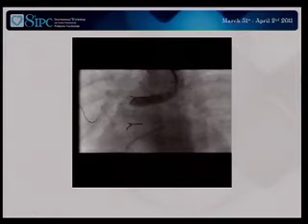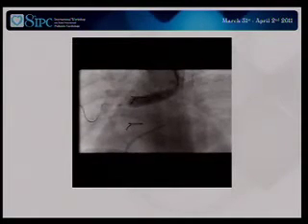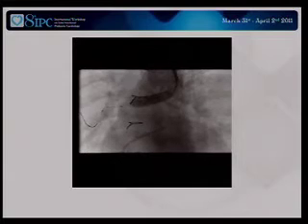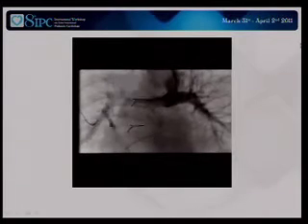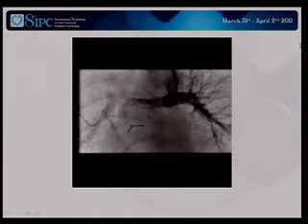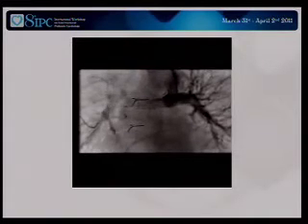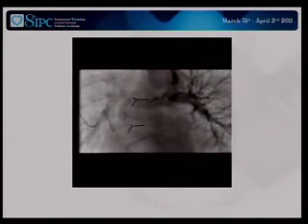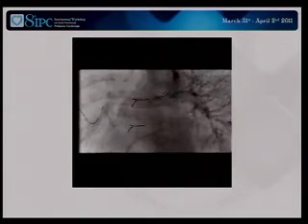You put a stent in the pulmonary arteries the last time. What was the stent? Who's the manufacturer of the stent you used last time? It was a regular Formula stent, pre-mounted stent, Formula 7 millimeters. There was no significant gradient between the right and the left pulmonary arteries. We knew at that time that the right jugular vein was lost due to previous surgery.